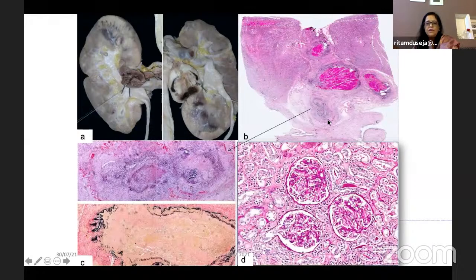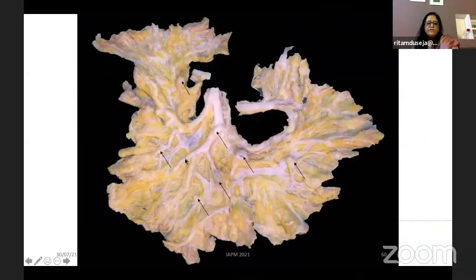This is one of the autopsy cases where this kind of aneurysm was seen, with a thrombus and the underlying arteritis being there. There's a break in the internal elastic lamina indicating evidence of healing here with a superimposed thrombus, and the underlying glomeruli being normal. That means it's not a microscopic polyangiitis or small vessel vasculitis involving medium vessels, but rather it's a medium vessel arteritis only. The mesentery did show these kinds of nodules.